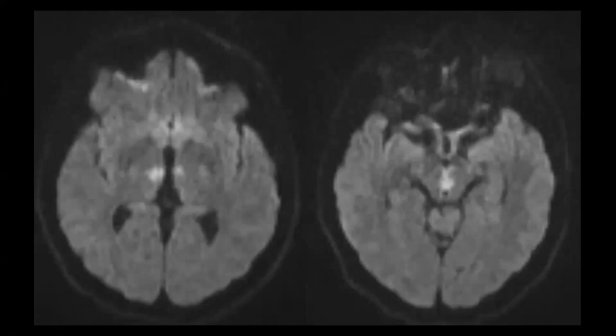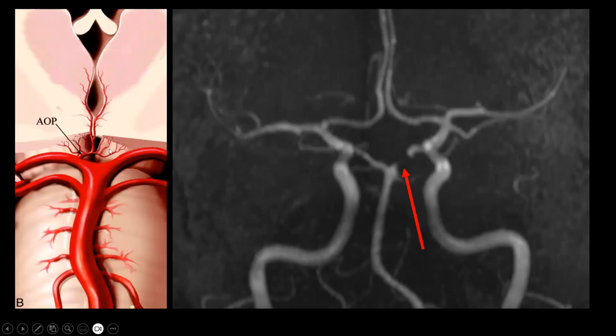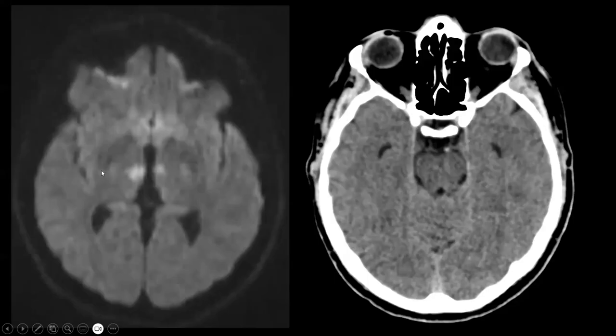This is once again a pattern that looks like an artery of Percheron infarction with infarctions involving the medial part of the thalamus on both sides and the central midbrain. And this patient had atherosclerosis. Quite clearly, there's some irregularity of the basilar artery and also of the P1 segment of the cerebral artery on the right side. And we see a total occlusion of the P1 segment. So the theory here is that the artery of Percheron probably originated from the left posterior cerebral artery, which is occluded in this patient. So we probably have to turn this image around and make the artery of Percheron originate from this cerebral artery to make it correct.